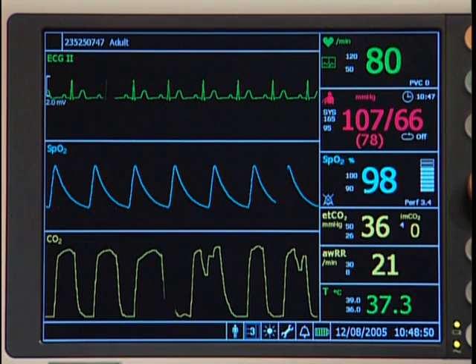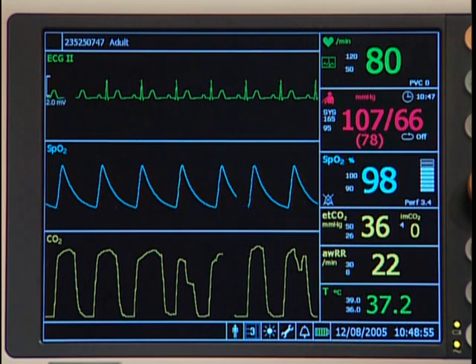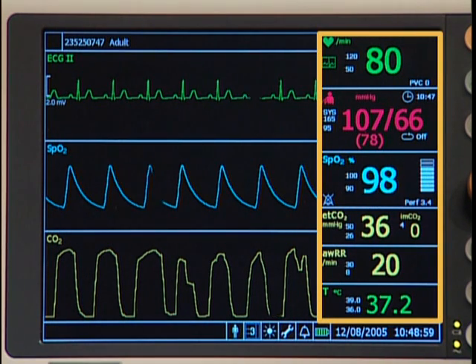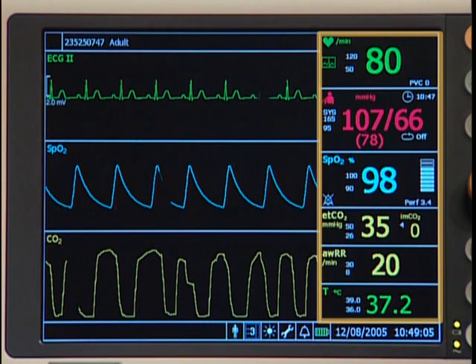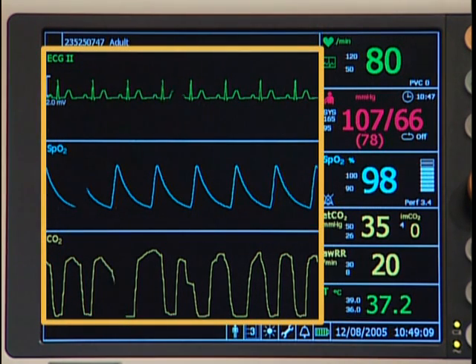Let's look at the rest of the main monitoring screen. The main screen includes a combination of different panes. Numeric panes contain display icons of the measured parameter, its numeric value, and its alarm high and low limits. Waveform panes display real-time waveforms of monitored parameters.